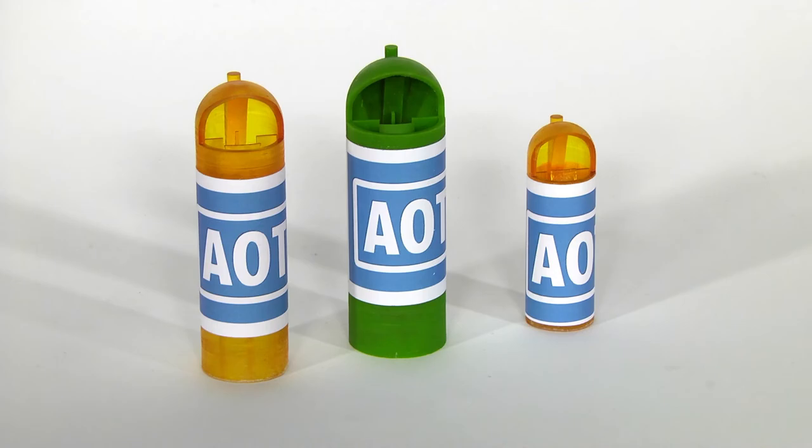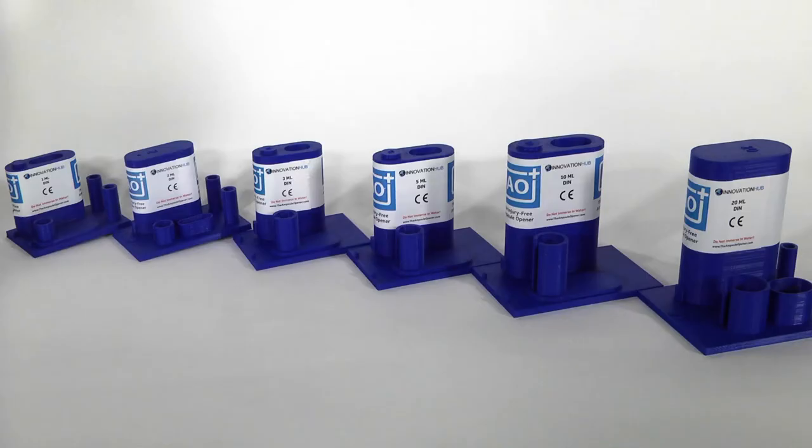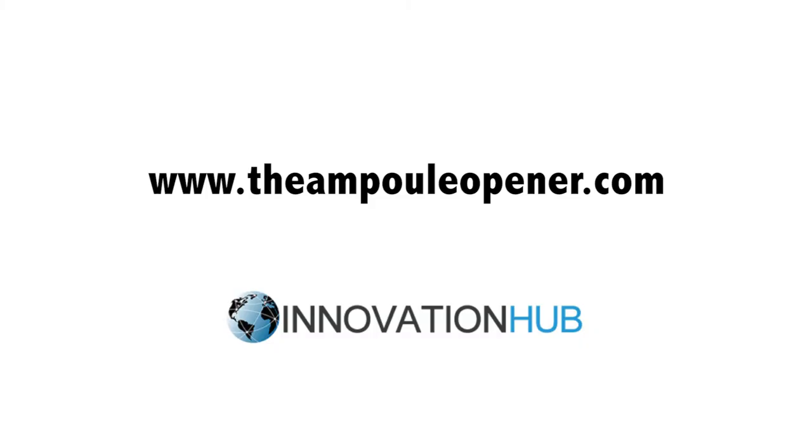AOT and AO Plus are not universal openers. They are made to suit each ampule size and shape in order to guarantee a safe, clean break, and your safety at all times. For greater information, please visit www.theampuleopener.com.